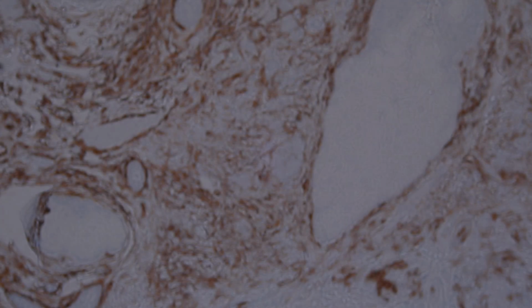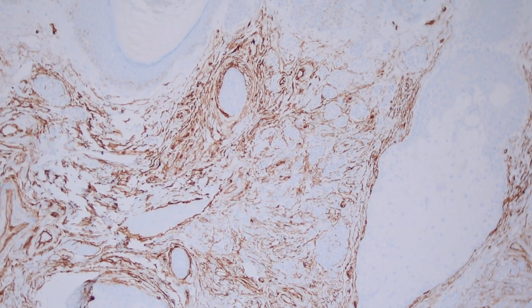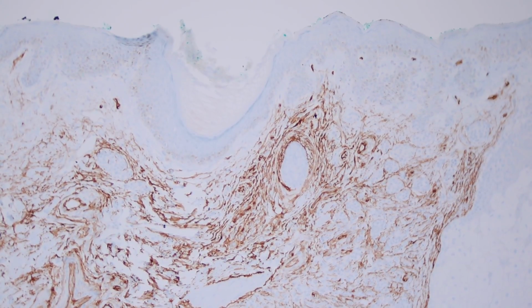So this stain right here is kind of staining a lot of stuff. The epidermis, you can see, and the adnexa are pretty much negative here. But the dermis is diffusely positive. All sorts of spindled and stellate cells all throughout the dermis are positive. This is CD34, and I think I wanted to show this part right here because this is important.